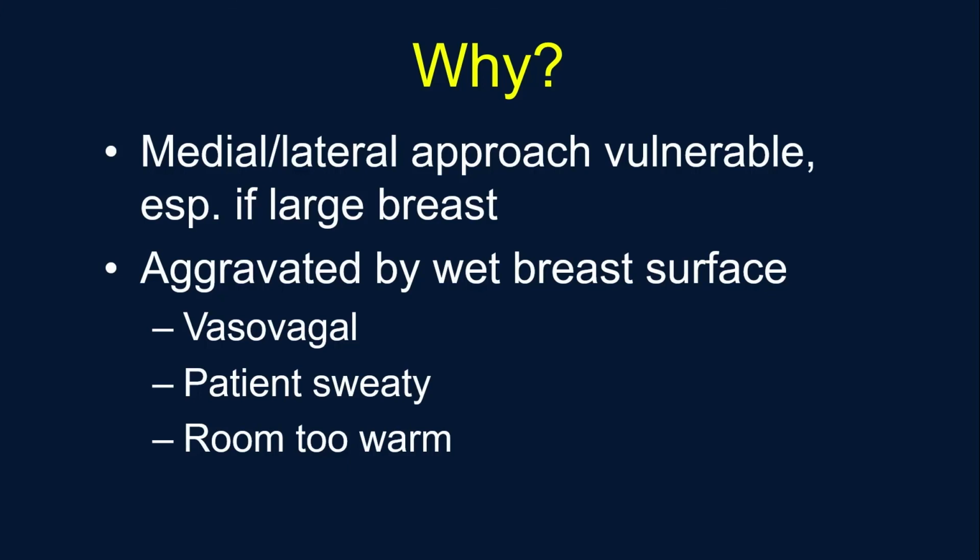So why? In an upright position, a medial or lateral approach is very vulnerable to lesion movement in the vertical location, especially if the breast is large and heavy. And it's further aggravated if the breast is wet. They have transient vasovagal reactions, they are sweaty, nervous, whatnot.